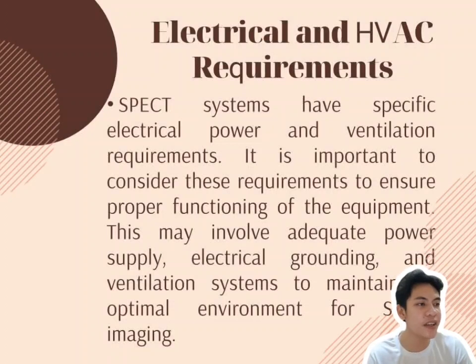Electrical and HVAC requirements. SPECT systems have specific electrical power and ventilation requirements. It is important to consider these requirements to ensure proper functioning of the equipment. This may involve adequate power supply, electrical grounding, and ventilation systems to maintain an optimal environment for SPECT imaging.